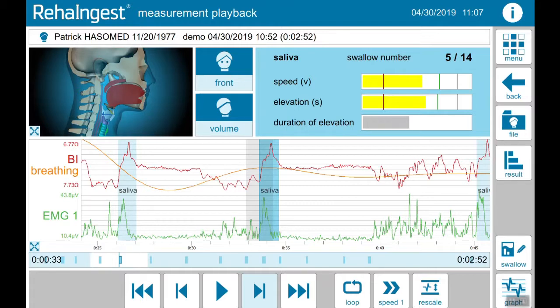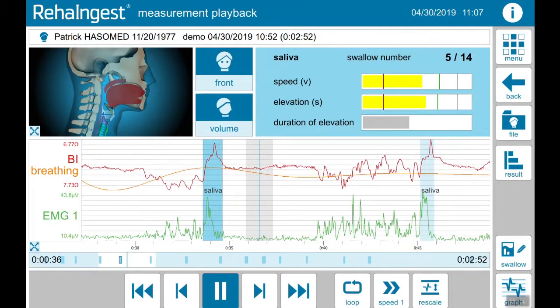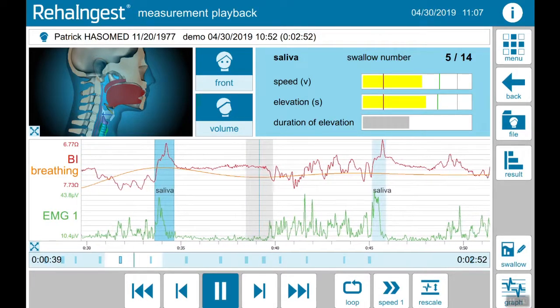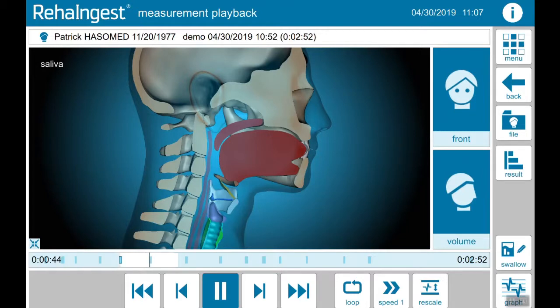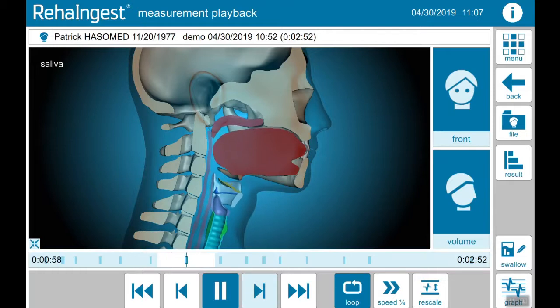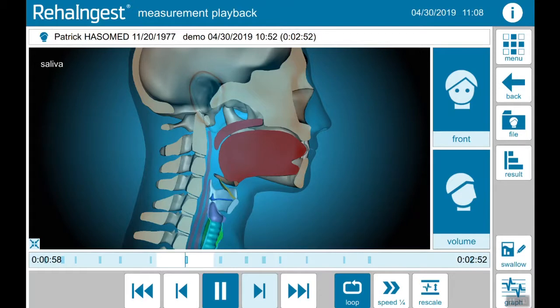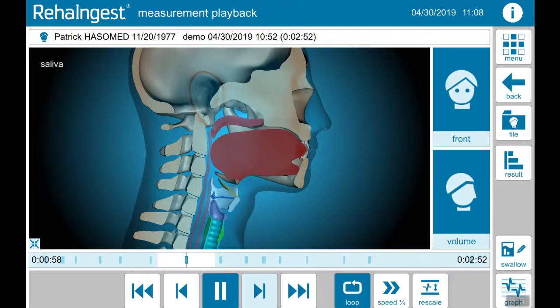If you want to see the physiological process, look on the top left. You see a 3D animation of the swallow. To zoom in, tap on the four arrows. If you want to slow down the speed, tap on speed and loop the next swallow. Now you see in slow-motion the current swallow. Please notice that this is an animation of the actual elevation and speed of the larynx and not just a video.